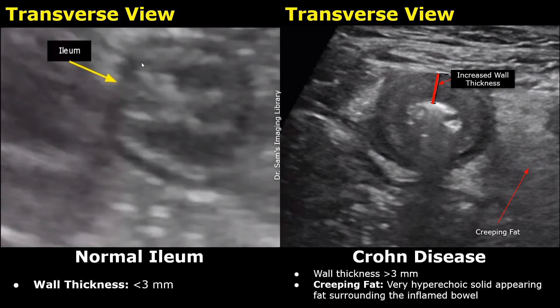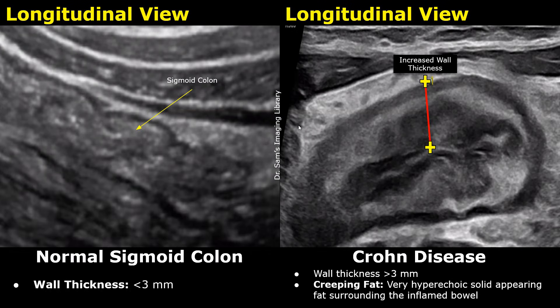This image shows the normal ileum in the transverse plane. The normal wall thickness should be less than 3 millimeters. This image shows a thickened wall surrounded by hyperechoic solid-appearing fat — this is called creeping fat. This image is of the sigmoid colon in the longitudinal plane. The normal colon is difficult to see on ultrasound. In the image on the right, we see a sigmoid colon with increased wall thickness in a patient with Crohn's disease. In this case, the wall stratification is preserved and creeping fat is present.